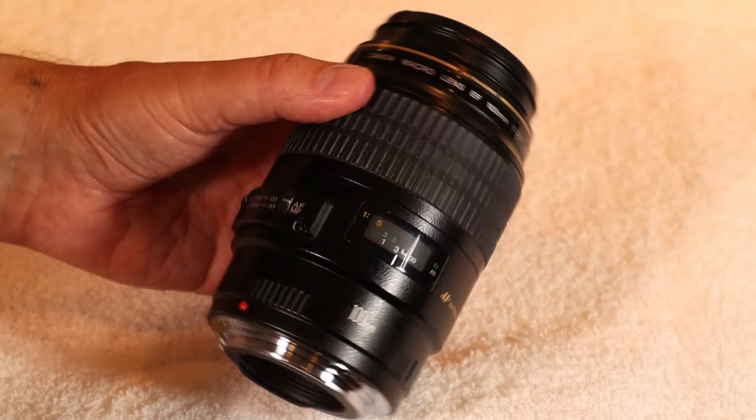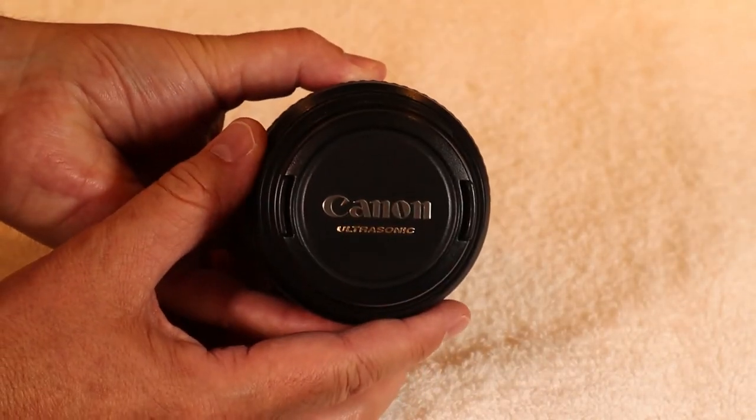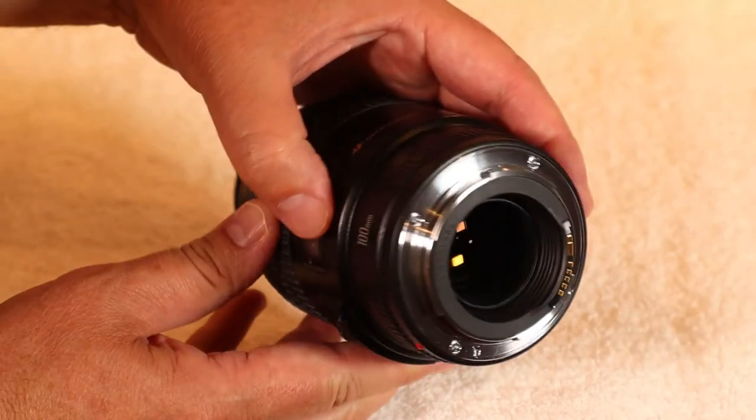The main lens I use to take tooth photos is the Canon EF 100mm 2.8 macro lens. This lens lets me take close-ups of individual teeth, close-ups of several teeth, a whole arch of teeth, a whole smile, as well as full face portraits. Since the lens is a fixed length with no zoom, I have to move the camera closer to or further from the subject depending on what type of picture I'm taking.